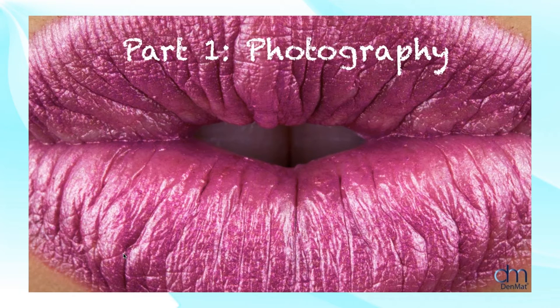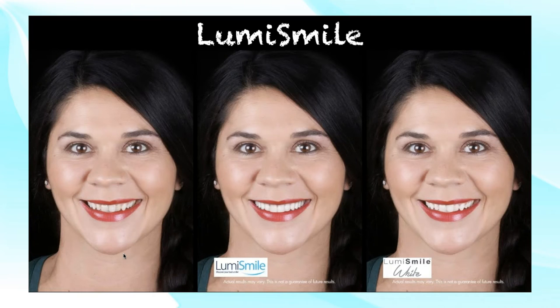So the first part is taking high quality photographs. When we take a high quality photograph, like the one we see right here with this patient, we're able to send this to the lab and communicate exactly what it is that we want. I want to introduce this concept that's offered by DenMat.